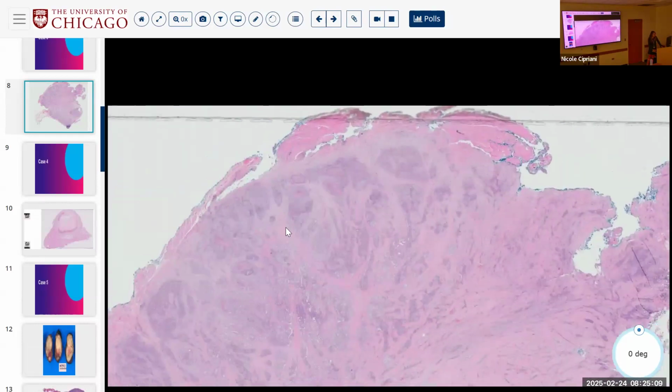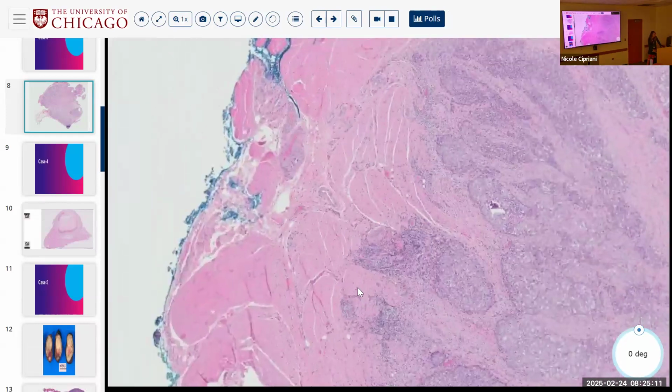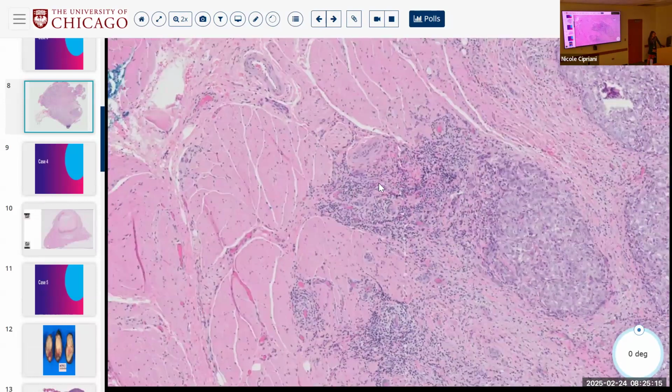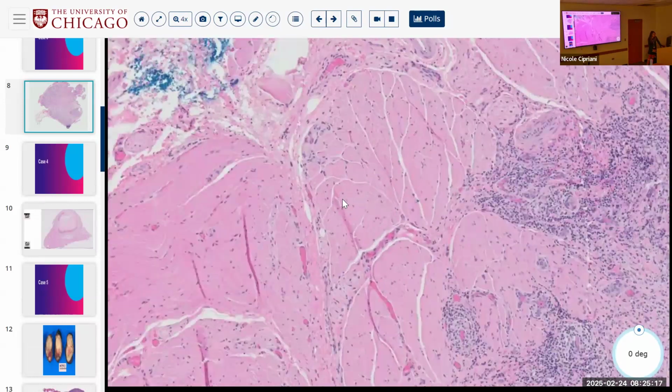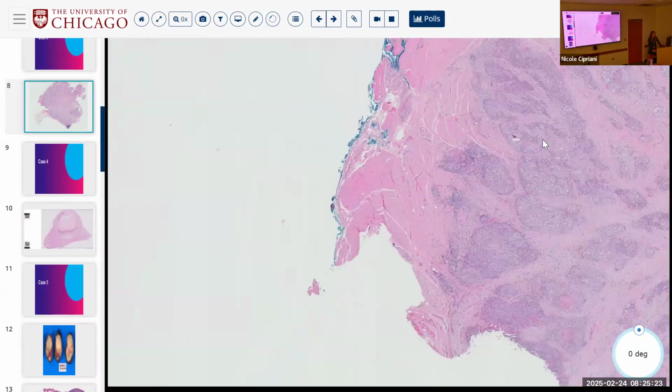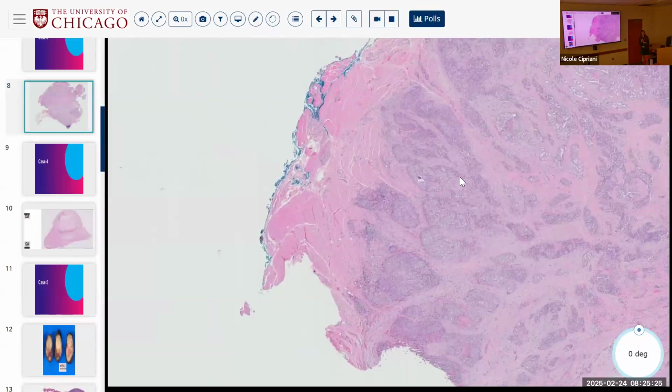Now at the periphery, what's happening out here? Going into the muscle. It's going into the skeletal muscle. So you have a high-grade thyroid carcinoma. You favor it to be papillary, so that's high grade, right? Now you have skeletal muscle invasion. What else does that make this?